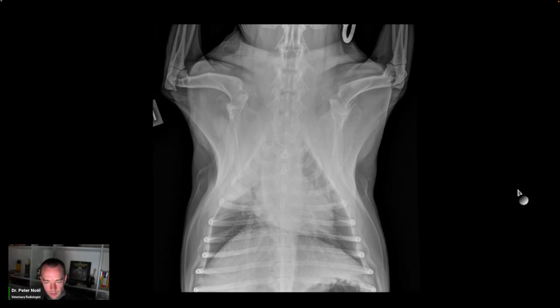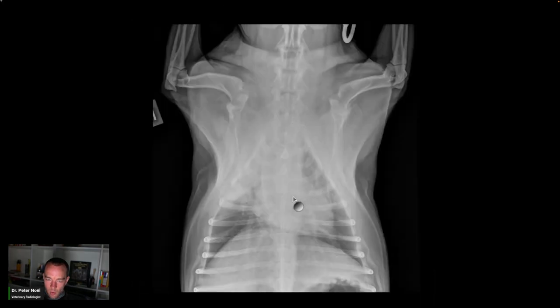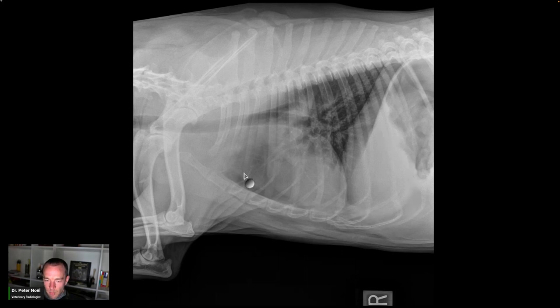Two views of the thorax. The patient is obese. The cardiac silhouette and pulmonary blood vessels are normal. The impression of a heart-based mass effect is the result of incidental fat. There is no abnormal widening of the mediastinum on the VD view; the degree of widening on the VD view is attributed to fat. Increased soft tissue opacity completely effaces pulmonary blood vessels in the right cranial lung lobe and yields a lobar sign with the adjacent right middle lung lobe. The cranial abdomen is normal. The pleural space is normal. Thoracic lymphadenopathy is absent. Maybe a little bit of OA in the shoulder joints.